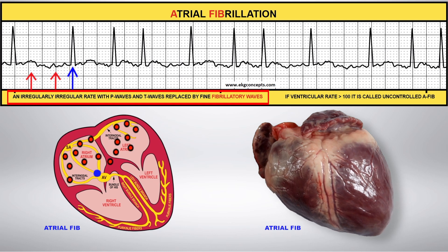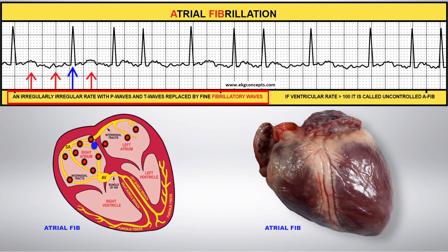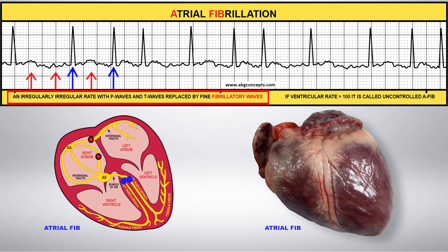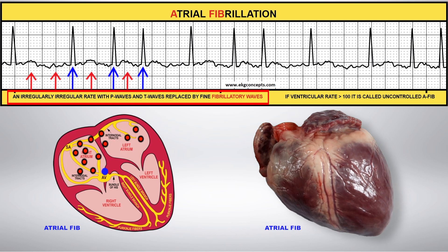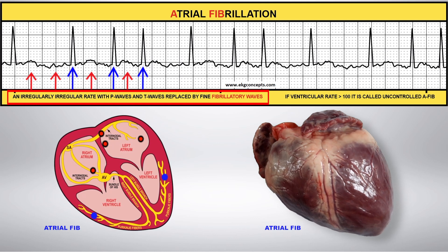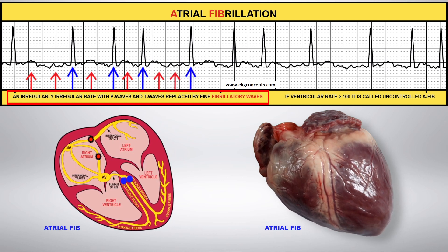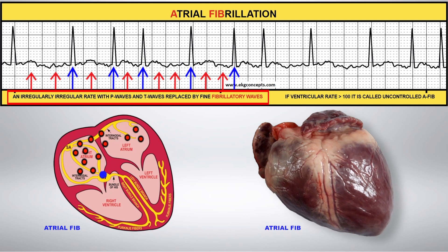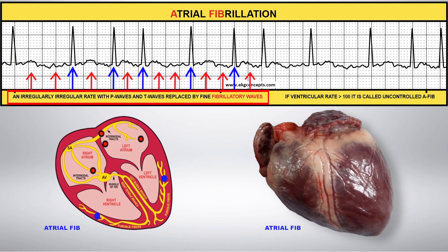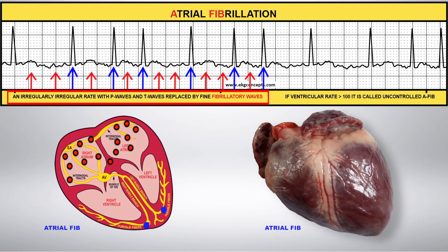Instead of pumping, the atria begin to quiver, causing fibrillatory waves illustrated by the red arrows. These chaotic impulses make it to the AV node, but not all of them make it through. This causes an irregular heartbeat, illustrated by the blue arrows.